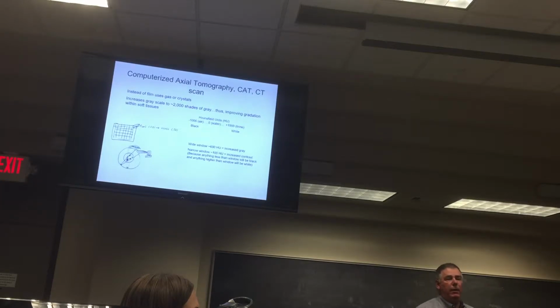Yeah. And in fact, you can actually change contrast on the digital X-ray machine over at Good Shepherd. You can sit there and make it bigger, make it smaller, brighter, lesser. So once these things get digital, you can do anything you want to with them, okay?